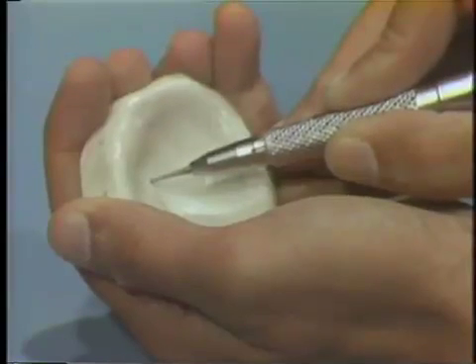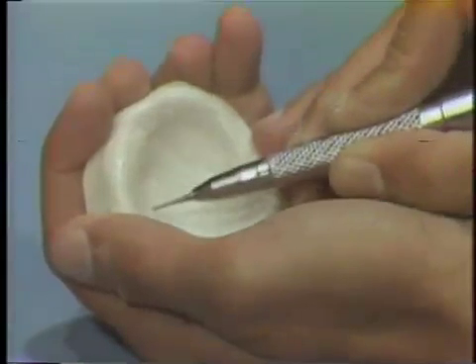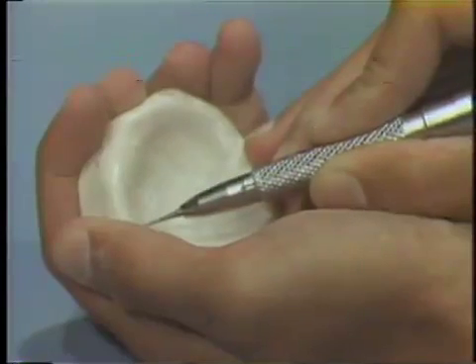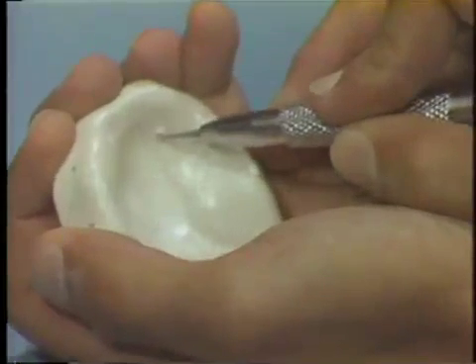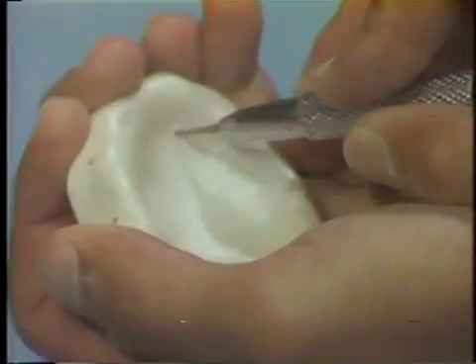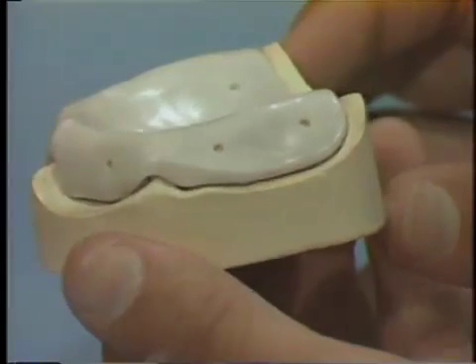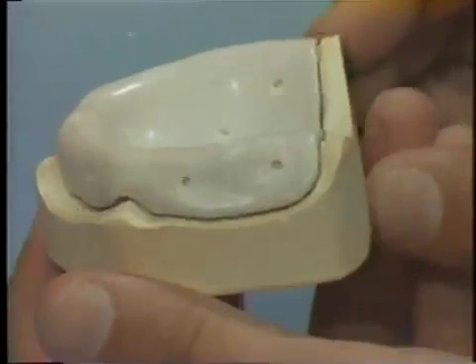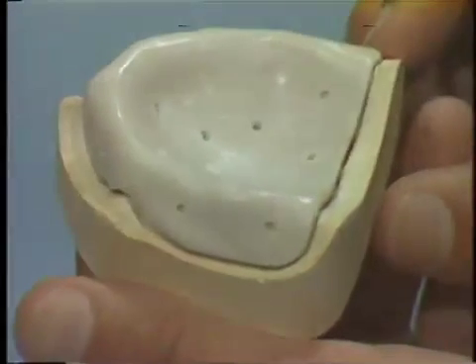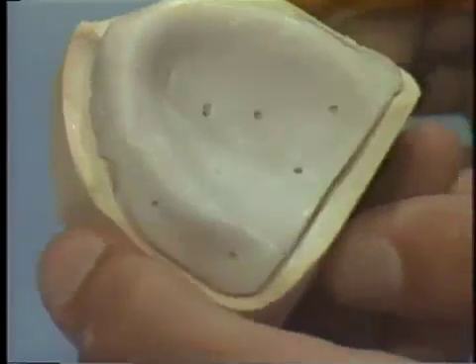You'll complete the construction of the maxillary final impression tray by placing approximately 12 holes in it using a number 4 straight handpiece round burr. The purpose of the holes is to relieve pressure and to avoid distortion of the tissues by allowing for expression of excess impression material when making the final impression. The borders of the tray are rounded and smooth and follow the denture base outlined on the diagnostic cast. The holes are evenly spaced over the tray, especially in the flange and palatal areas, and there are no holes directly on the residual ridge crest area.